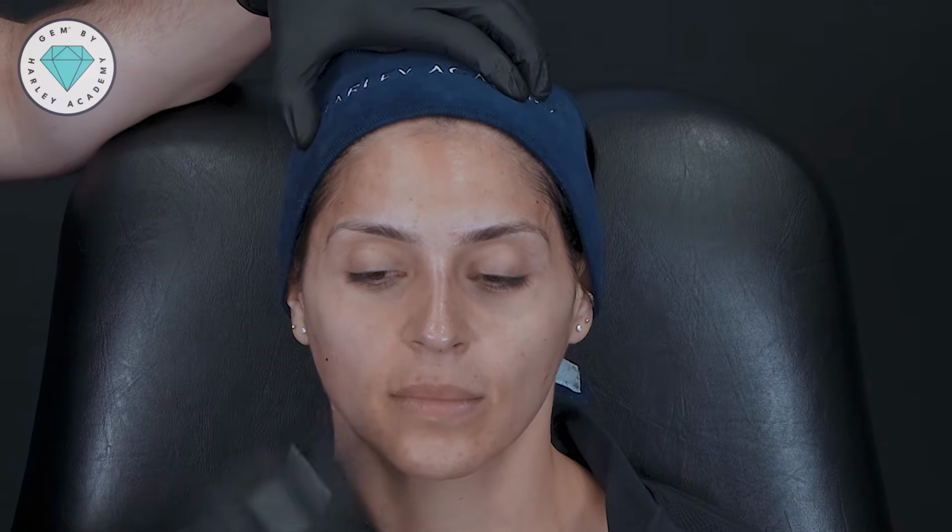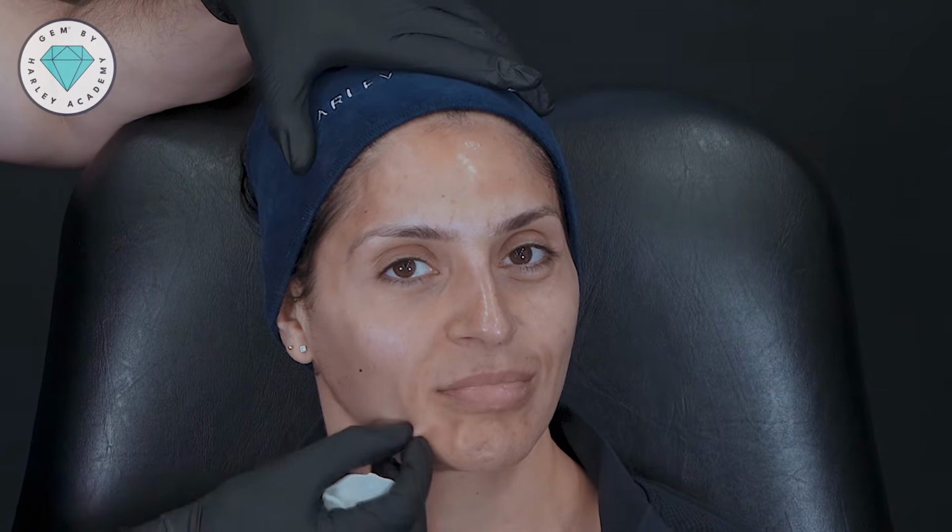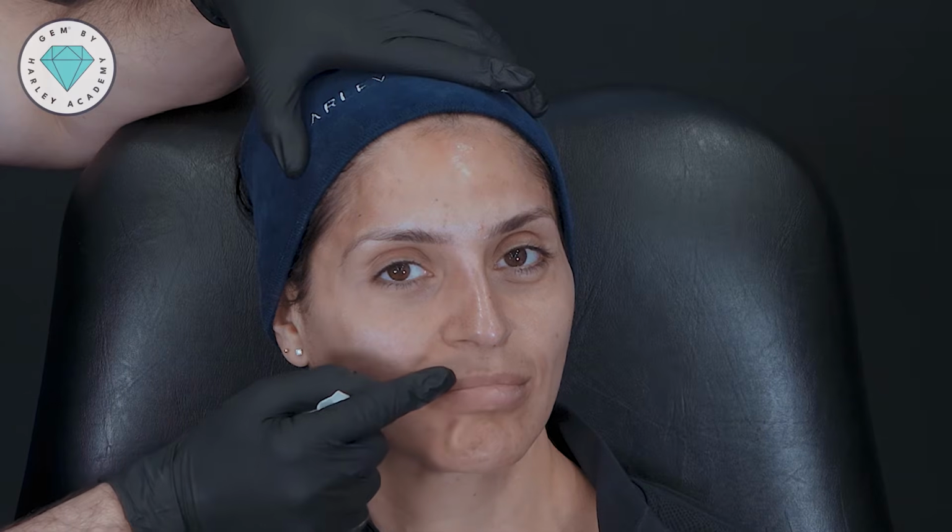And with the remainder of that gel, I'm going to inject it into the lower face on top of these muscles of facial expression. So if you stick your bottom lip forwards for me, like this. Yeah, exactly like that. These muscles are quite active, and if we can detach the skin from those muscles, what we'll create is a really nice softening of the expression in the lower face. And so if I can blend my filler that I'm going to use on my lip with just a little bit of fanning in the lower face, we'll really start to see the difference there. That would then give me my full treatment result, and we'll see everything.